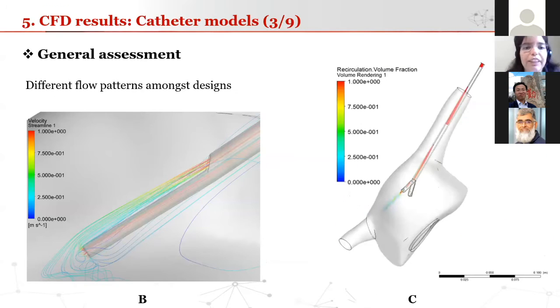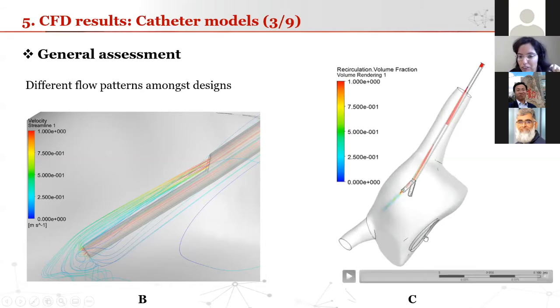Then after inserting the catheters, we also started by looking into velocity of flow and blood flow patterns. So here on the catheter B, we can see that there is flow coming in through the upper lumen, and then this amount of flow is returning backwards into the other lumen, which is what we don't want to occur, but I'll deep dive into it later on.